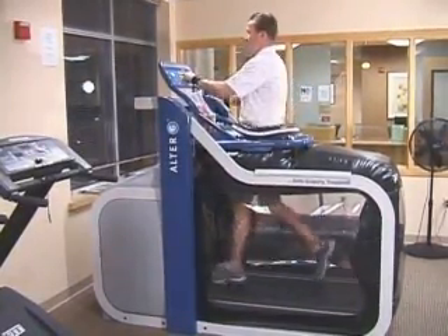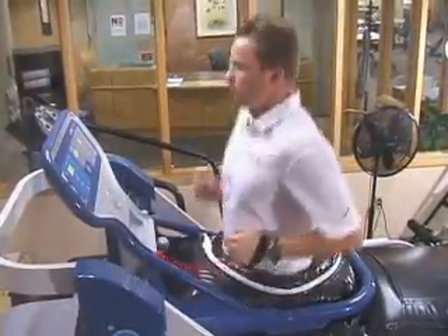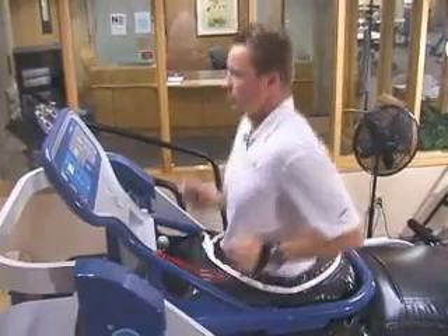Uniquely to Alter-G, you can freely and precisely adjust your body weight and thereby the impact on your lower body, while retaining normal movement.